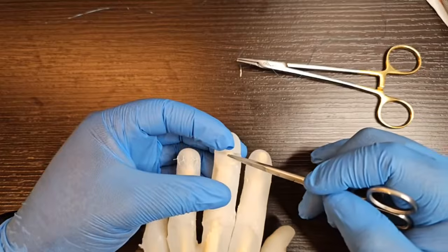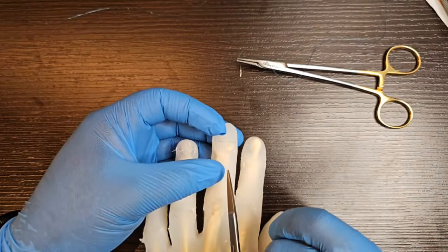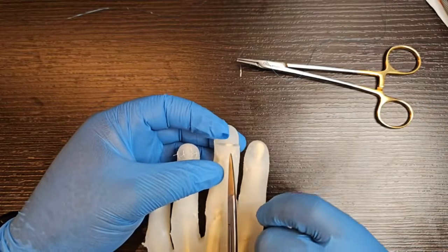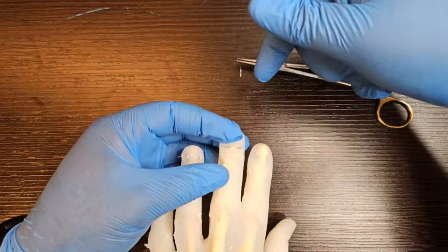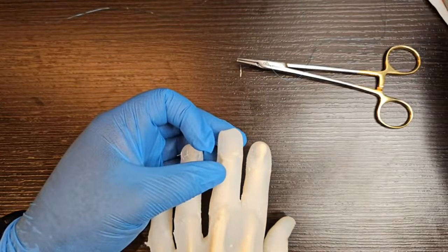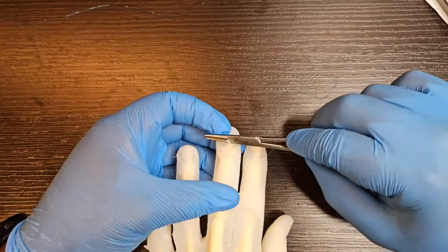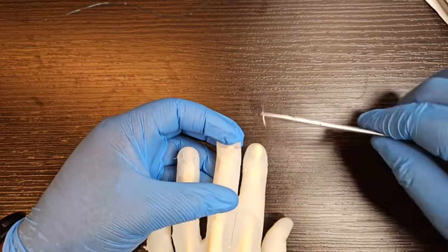But if you need to do a K-wire and there's a fracture here, you can do it under direct vision. You can fire it antegrade. So you need a double-ended K-wire. Fracture bone, distal fragment here, proximal fragment here. You fire the distal fragment here, through there, come out the end, and then fire it retrograde. Once you've reduced it, fire it retrograde back down the phalanx into the middle phalanx and do a check x-ray. Once you've done that, you then need to start your repair by stitching the pulp injury first to align the nail bed, and then you suture the nail bed itself.